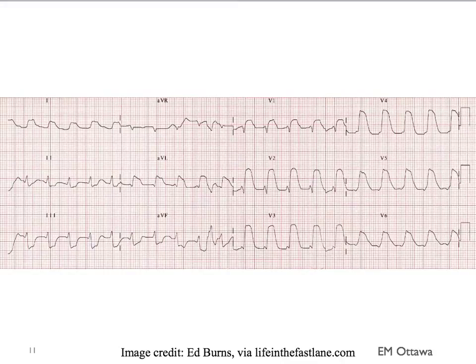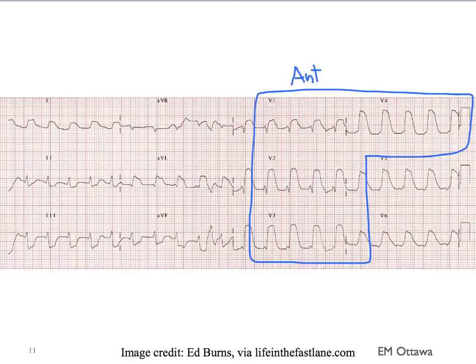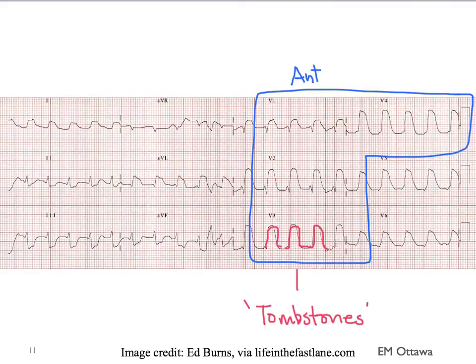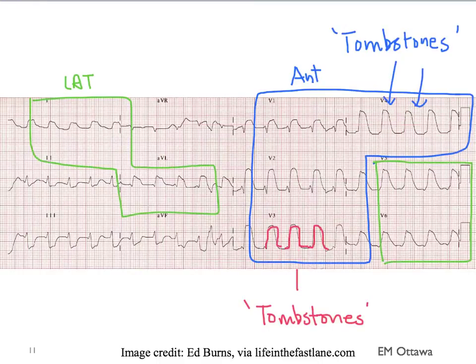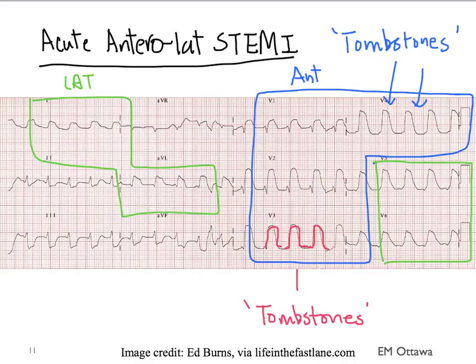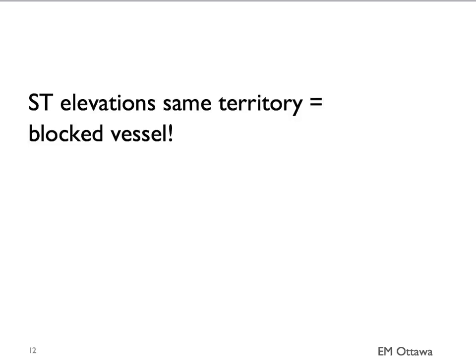Looking at this next ECG — there are ST elevations in multiple leads, including the anterior portion of the heart. Pay special attention to the way the ST elevations look in the anterior leads: they have rounded tops, also known as tombstones, which are particularly worrisome for infarcts. ST elevations are also visible in the lateral leads with tombstones as well. This is an acute anterolateral ST elevation MI. Every time you see ST elevations belonging to the same territory, you have to think there is a blocked vessel.